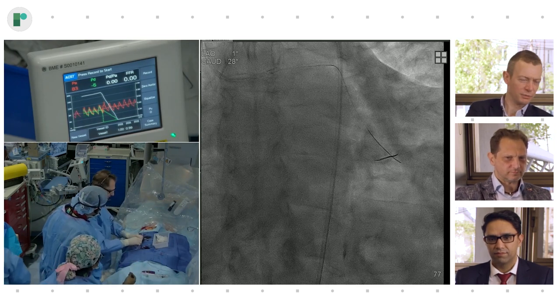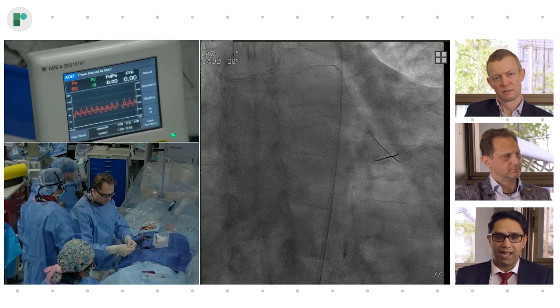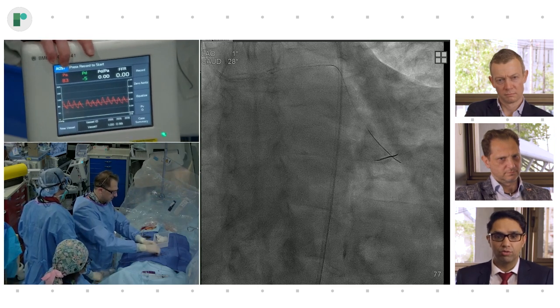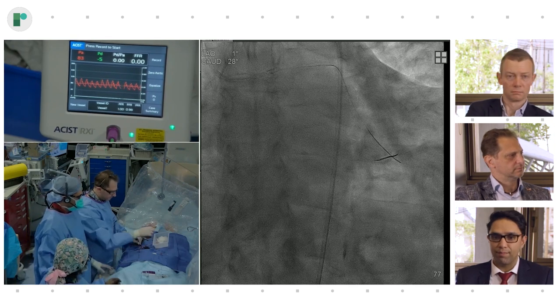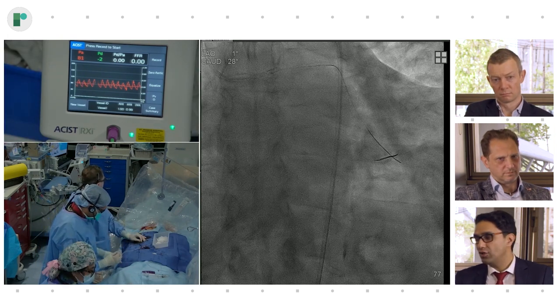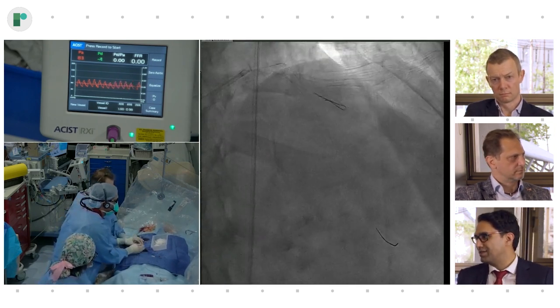So you want to elaborate a little bit on the concept of the Navvus catheter, Ziad? Yeah, sure. The Navvus catheter is basically a microcatheter, a rapid exchange system that's got the pressure sensor at the distal tip. The advantage is that you're able to use your workhorse wire, and quickly deliver in a rapid exchange way to multiple vessels, so the workflow is very similar to using a balloon, so it's very easy for people. And you don't have to worry about damaging the tip or not getting a good curve on it. It's really very utilitarian.